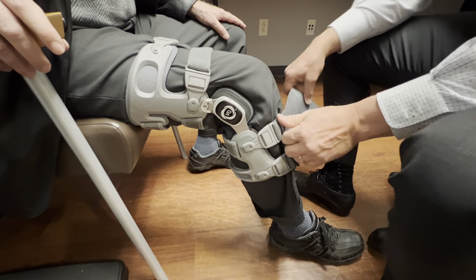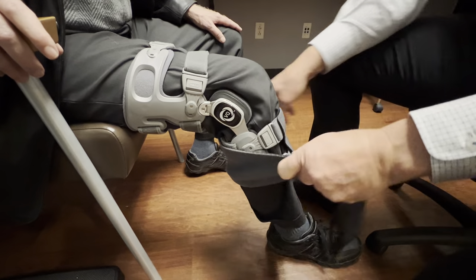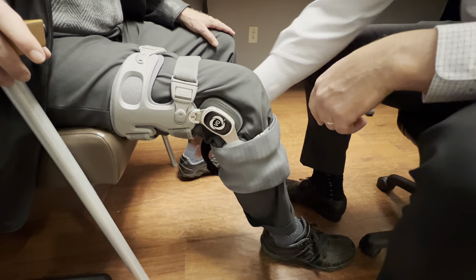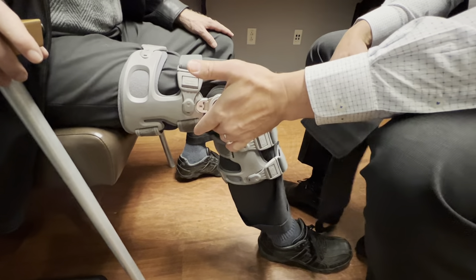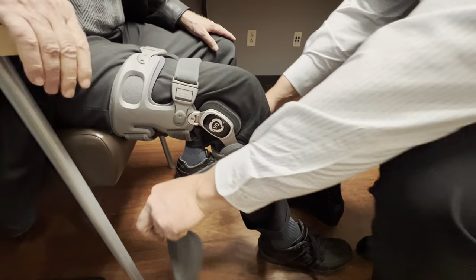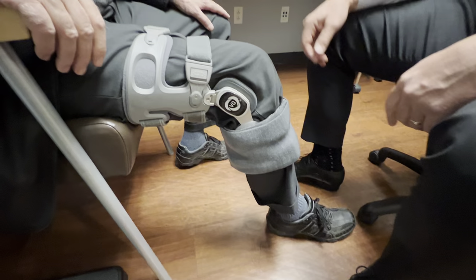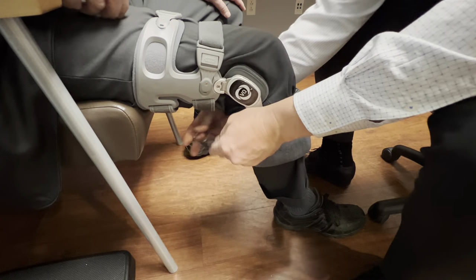It just wraps around and velcros here. One common mistake is putting it on the other way — as you can see nothing really changed and I didn't pull the brace out of position, but we'd rather you put it on the correct way so you don't risk pulling the hinge forward. So: outside to inside, clockwise from your perspective. That's the whole brace applied.